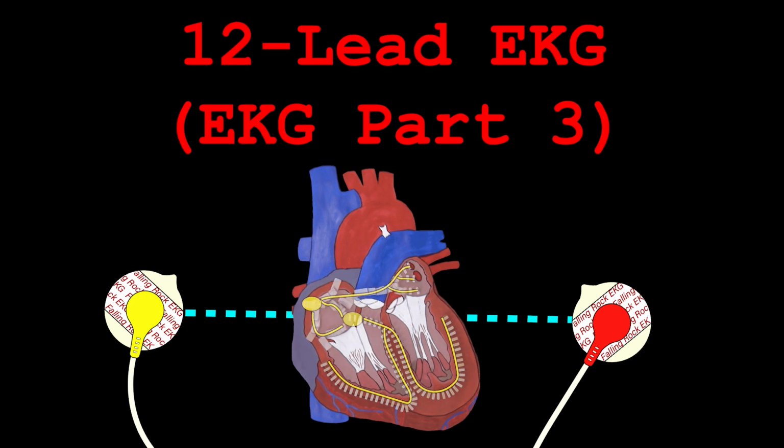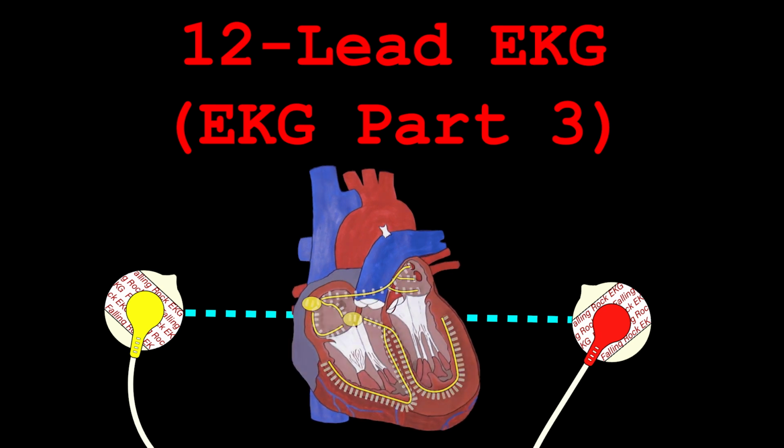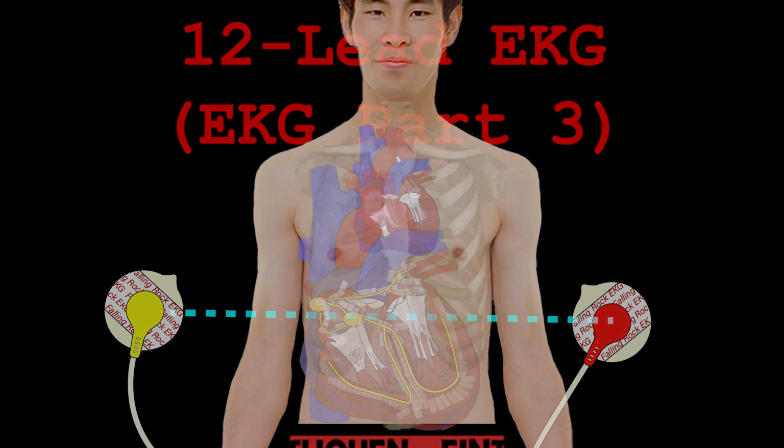In this video, we will show you how putting electrodes around the heart creates 12 unique points of view of heart conduction, which we call a 12-lead EKG. Let's start with how electrodes work.